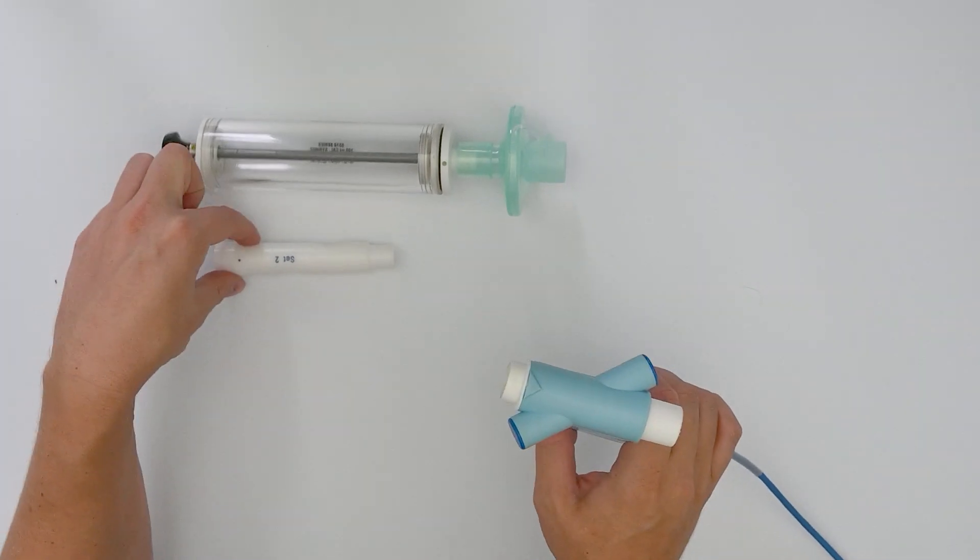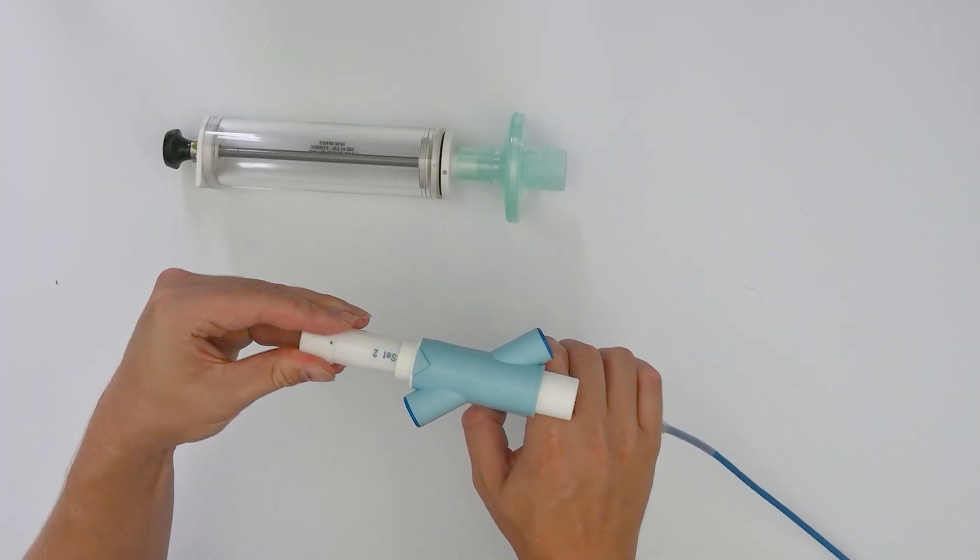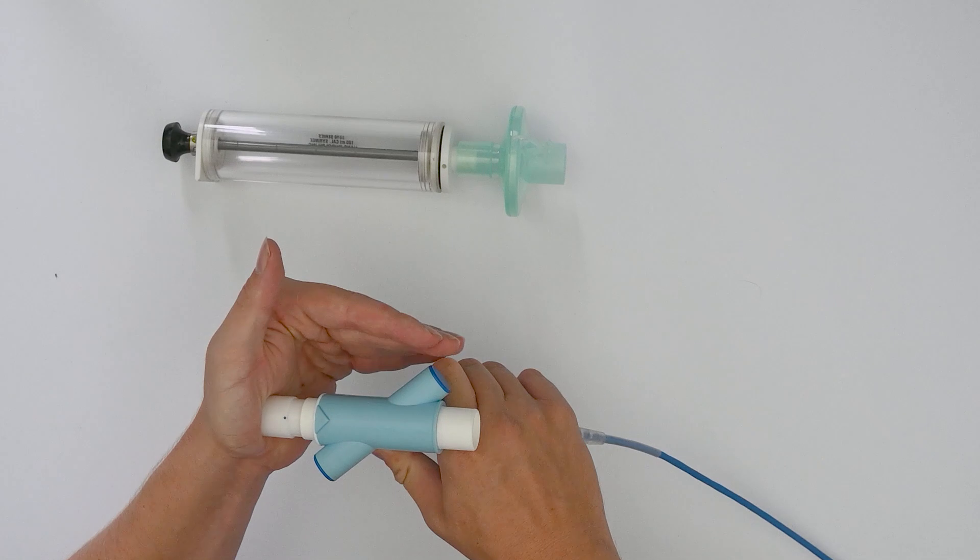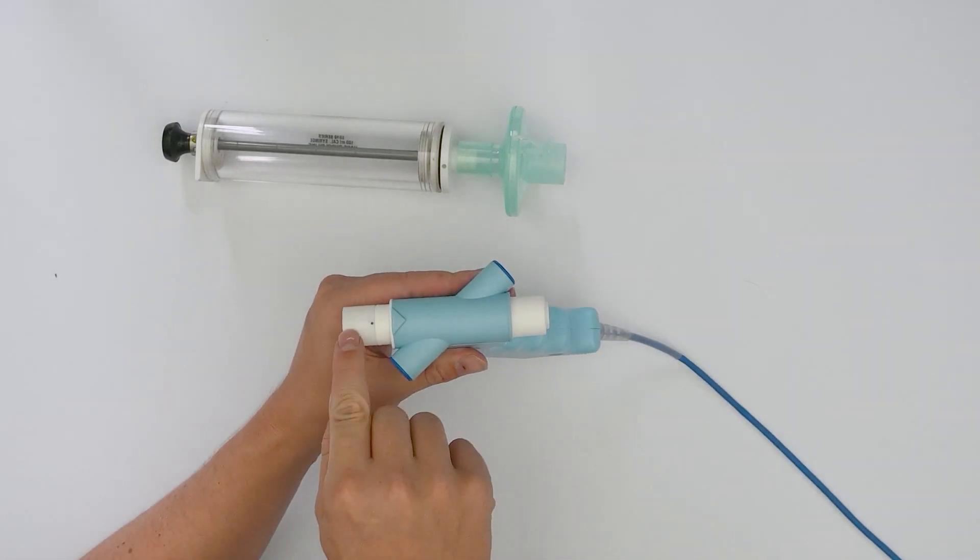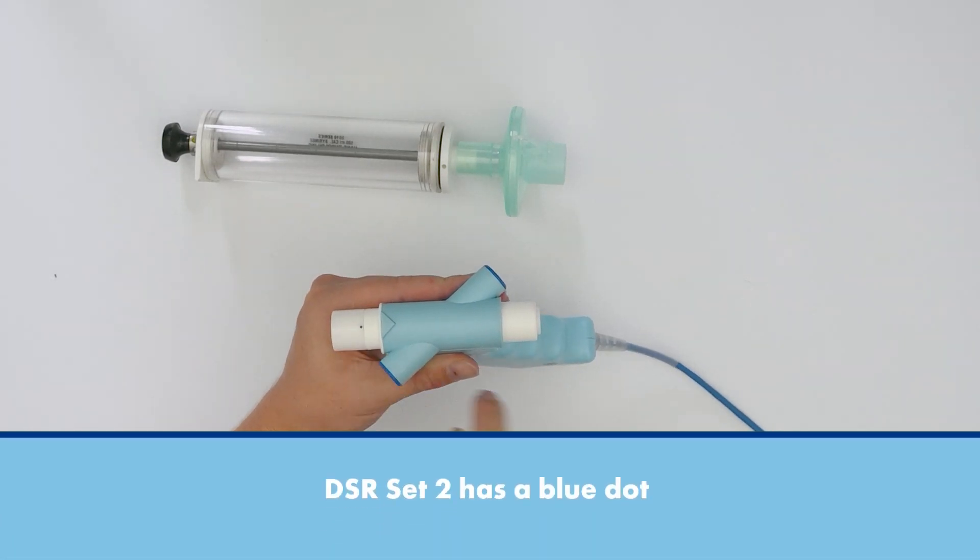Then, insert the dead space reducer, which you will need for your measurements. Be sure to line up the dot on top of the dead space reducer with the triangle of the spirette and flow head.